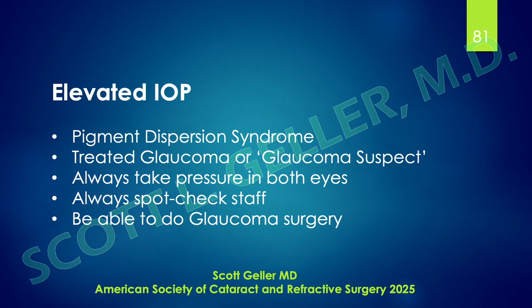Well, in a couple weeks, the patient still had very decreased vision, almost destroyed vision. The staff took a pressure with the Tono-Pen, noted it in the eye chart. The pressures were normal. I'm not sure exactly what the operating ophthalmologist saw, but he took a little closer look finally. He might have seen some microcystic edema, who knows. But he took a pressure with a Goldmann applanation tonometer. The pressure was like 45 or 50.